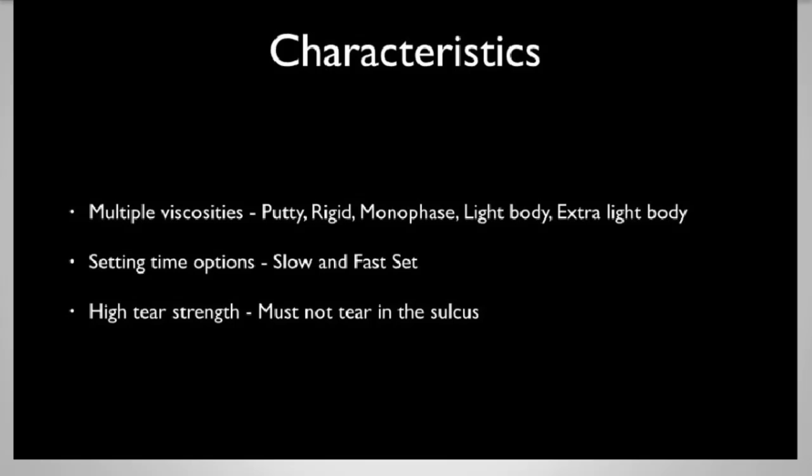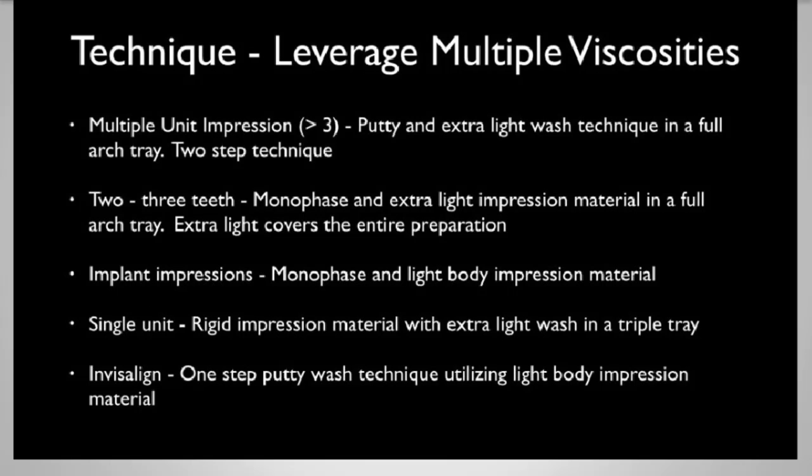At the same time, if I'm taking a single unit impression, all I need is a fast set material. If I'm impressing 5, 6, 7 teeth, then I need a very slow setting material. So we don't want to unnecessarily leave an impression tray in a patient's mouth longer than it needs to be. We want to use what's appropriate. We'll go through a few different techniques here. So forgive me as I go through these with you and how I use multiple viscosities.